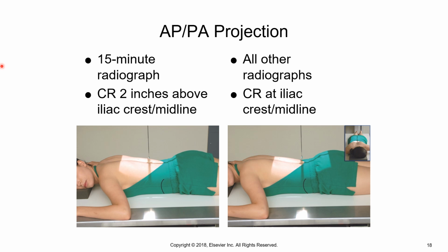I recognize the book says lower, but I'm going to tell you that we rarely go below 90 when we have the water soluble contrast media. The technique on either, if you do an AP or a PA small bowel image, your technique is 110 at 2 for single, 90 at 2 for double or water soluble.